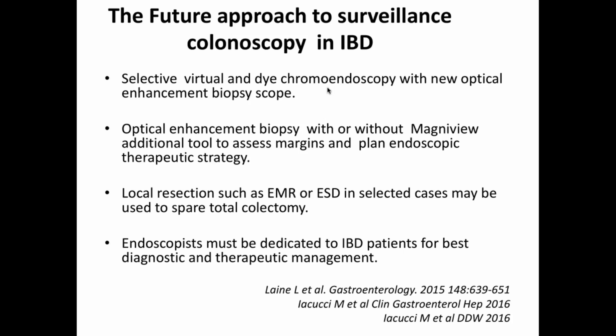Perfect. Thank you very much. We are also moving in another direction. In the future, the surgeon is also considering segmental resection, because with the new technology, expertise and experience, we feel quite confident to perform surveillance in the future in these patients, also with segmental resection.